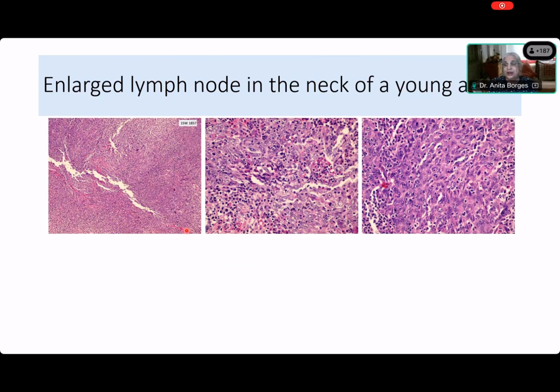So then what? But what is it? Is it epithelioid? Is it mesenchymal? Is it round cell? Ma'am, this is epithelioid. Epithelioid. Very good, Aishwarya. And this is how, my friends, you have to do your daily diagnostic work. It is not very pleomorphic, but it is epithelioid.